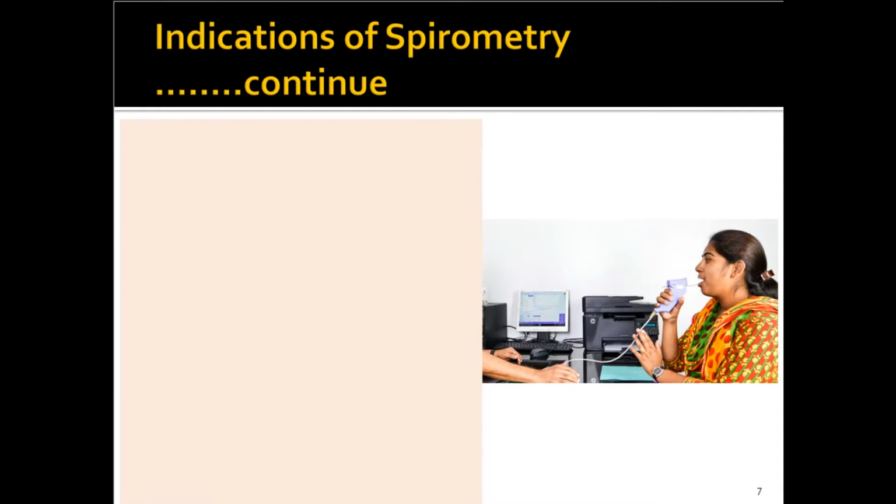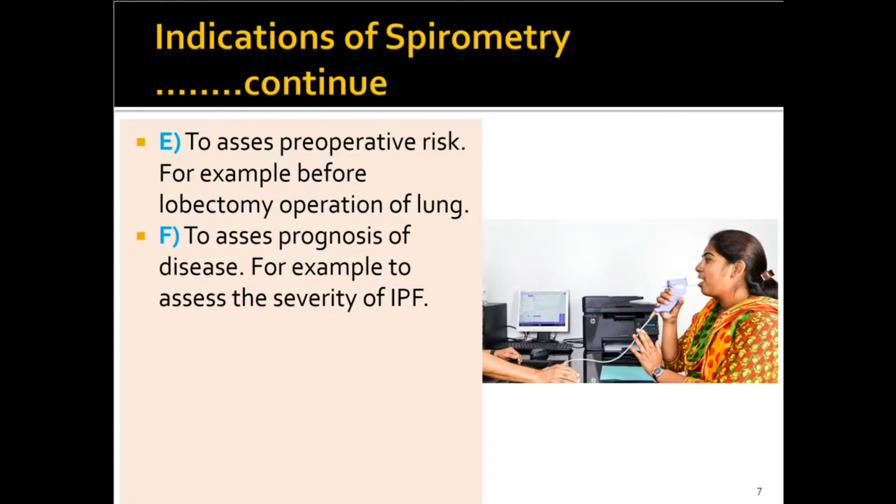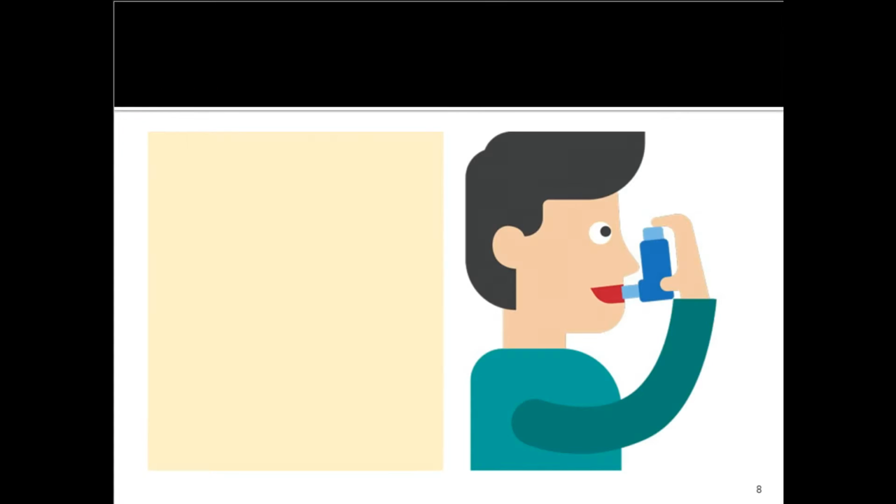Indications of spirometry continue. E. To assess preoperative risk. For example, before lobectomy operation of lung. F. To assess prognosis of disease. For example, to assess the severity of IPF.